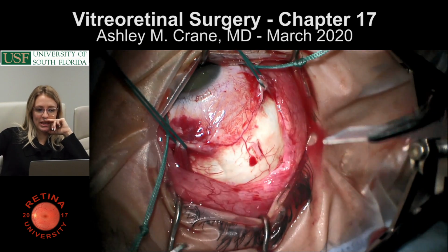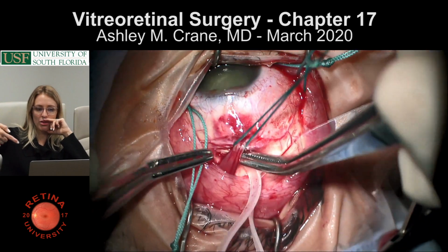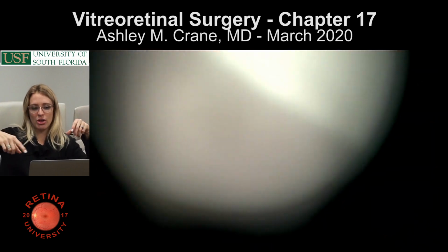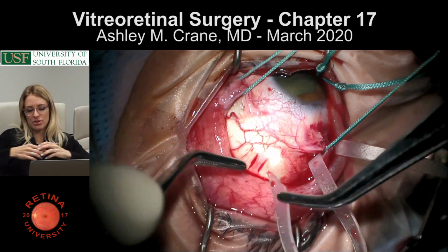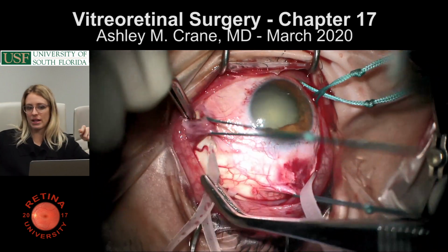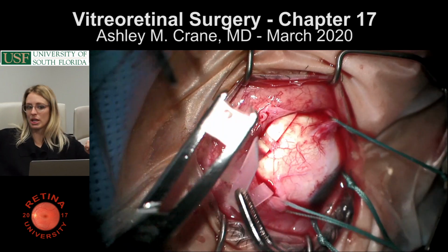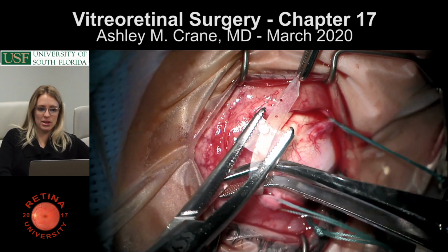And then you pass the buckle. If anybody's not seen a buckle, you pass the buckle, if it's an encircling buckle, through those loops and under the muscles, and there's another kind of silicone sleeve that connects the two ends, and then you pull it up. And basically, the same way to do this is with sutures.